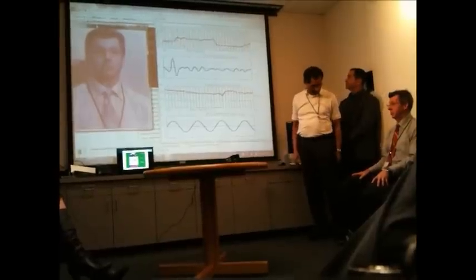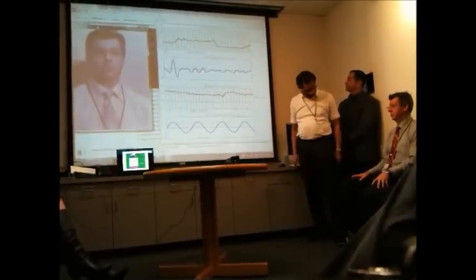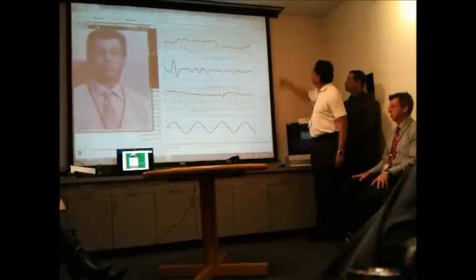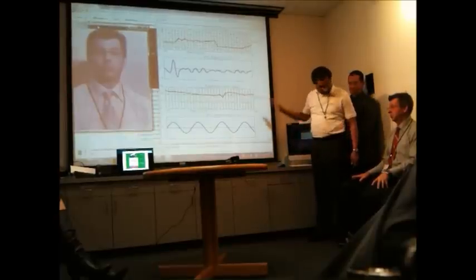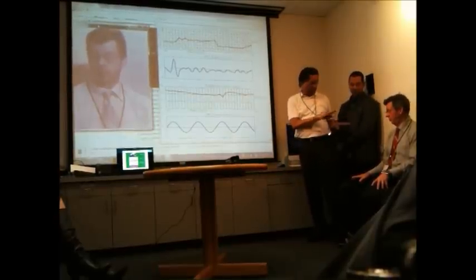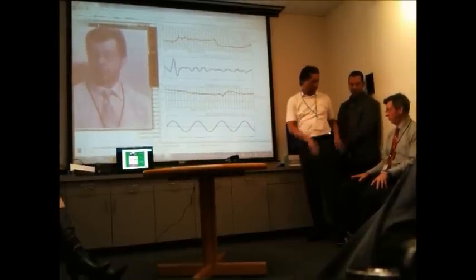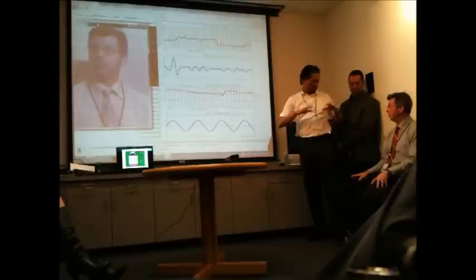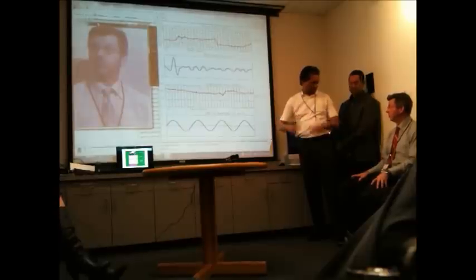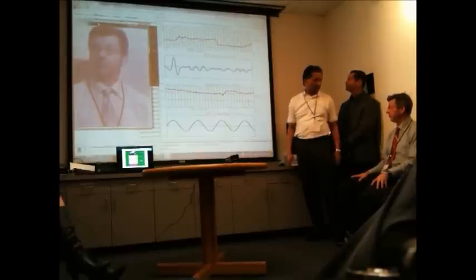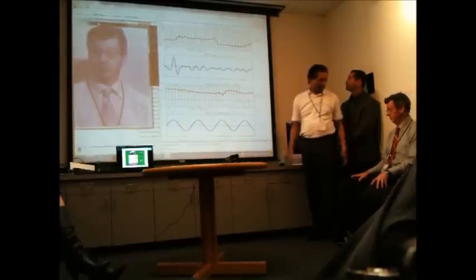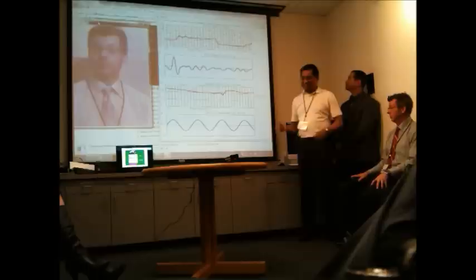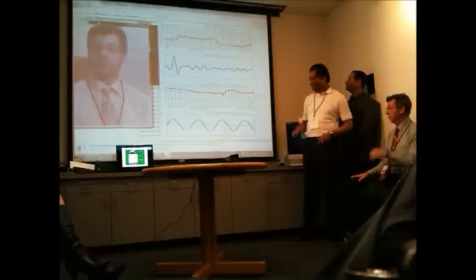The pulse rate showed 74. It's not exactly the same as the earlier reading, but heart rate changes between different measurement instances, so some variation is expected. That concludes the first demo.